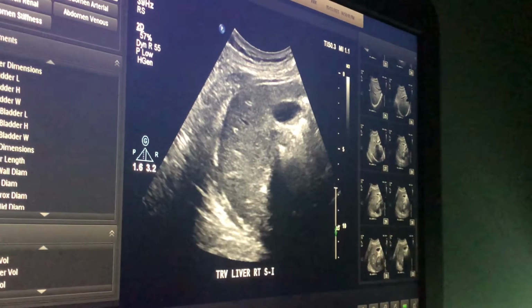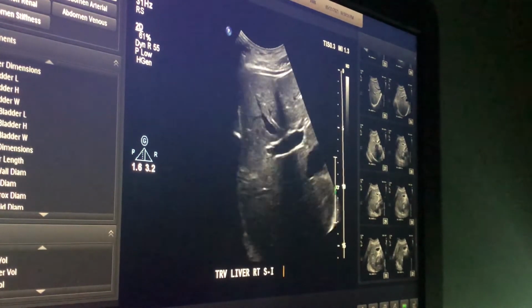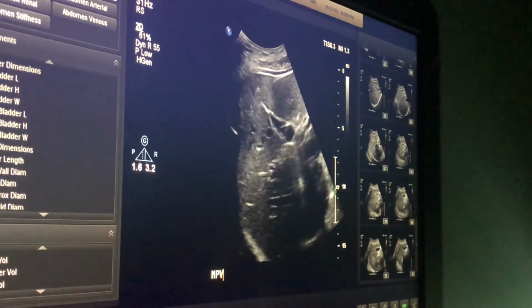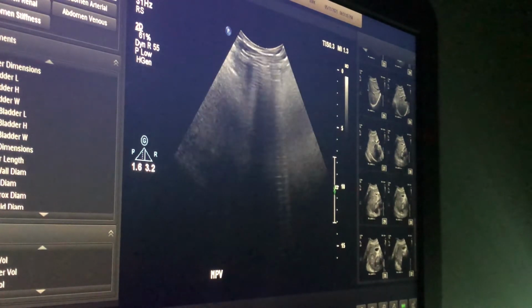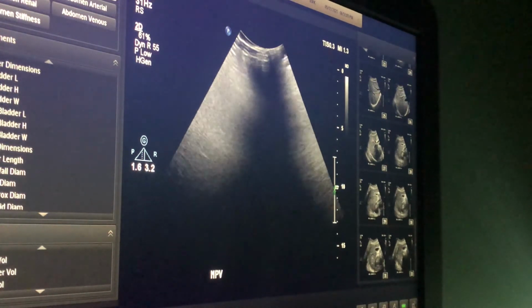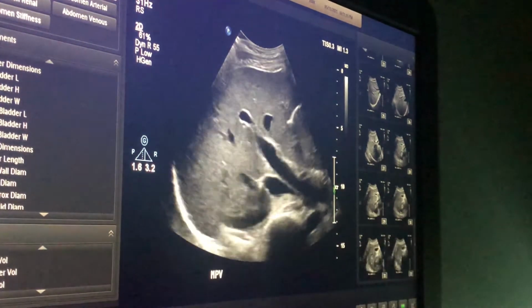Okay, patient, breathe. All right, so next I'm going to look at the vasculature of the liver, specifically the main portal vein first. I'm going to go from an intercostal window for the main portal vein. That's where it looks the nicest for color and for spectral. So I can see it really nicely elongated through here in grayscale.